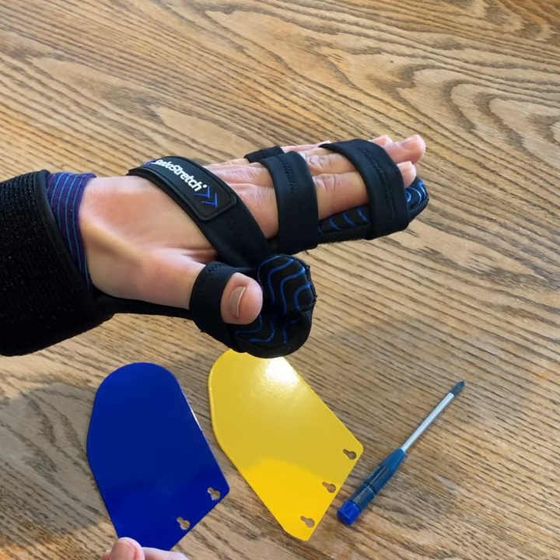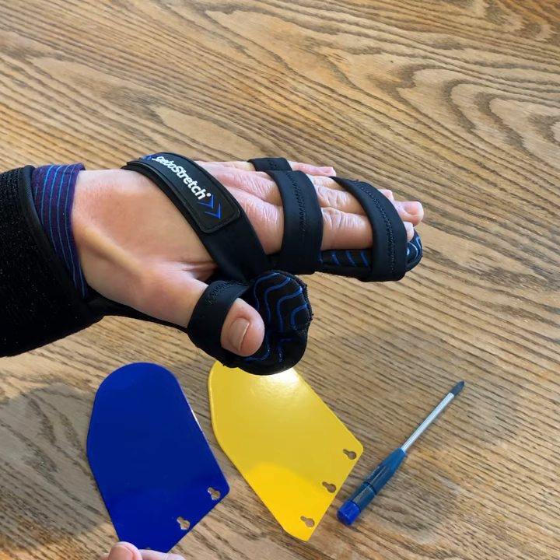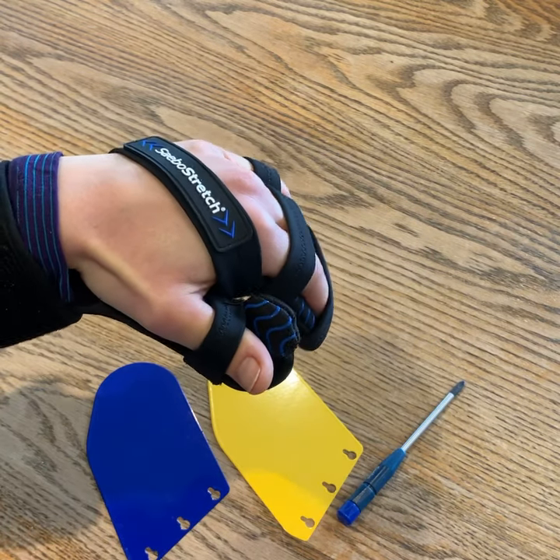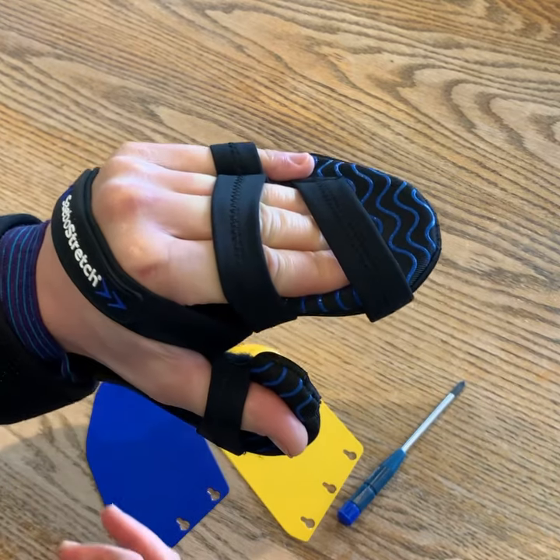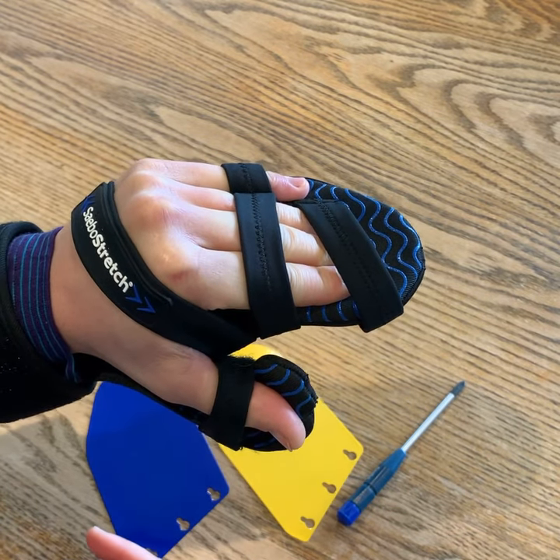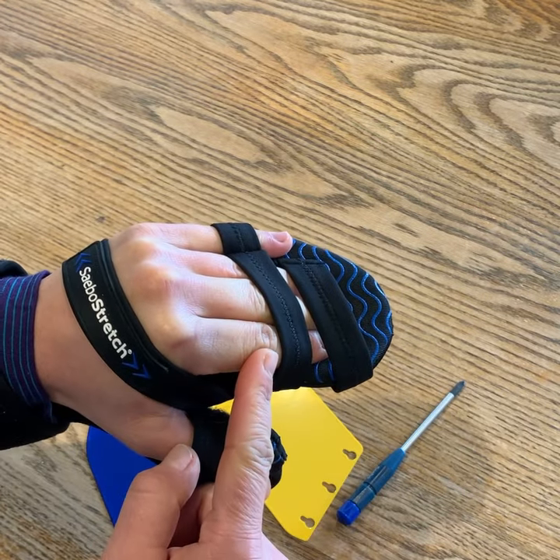This means if your hand has a tendency to involuntarily claw and curl into a fist, it will stretch with it but it will always spring back into position again, so you don't get your hand pulling out of the splint, which can be painful and can potentially damage the joints in the fingers.